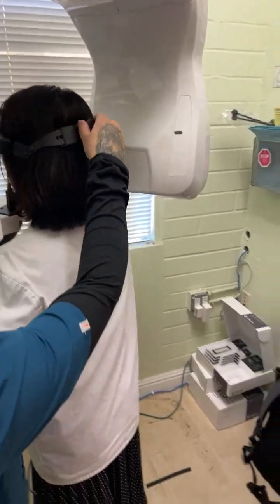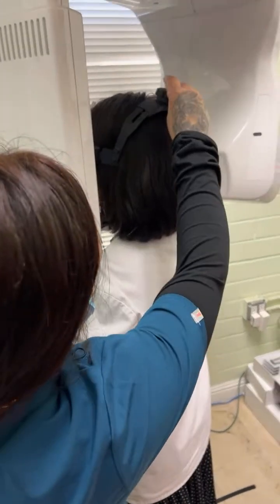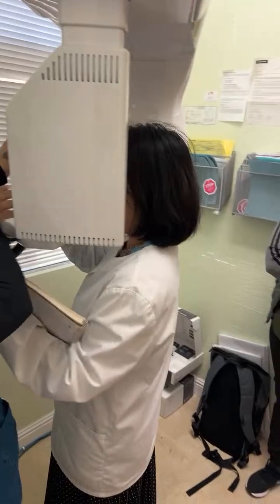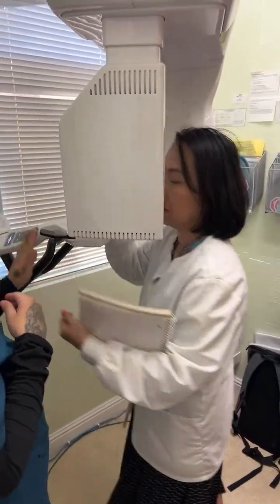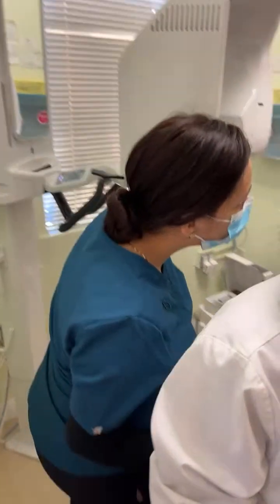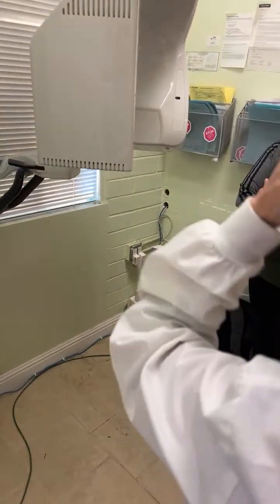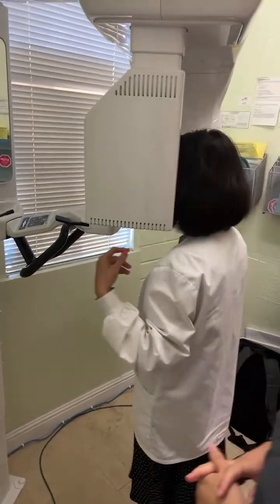I think everybody needs to try it. You try it too. Okay? And release it. Put it back and lock it. After we're done with every patient, we have to lock it. No, stay in so she can try one more time. Because if it's forward, then they can't try it when they come in and hit the sheet.